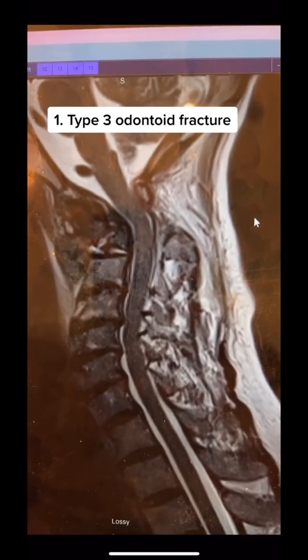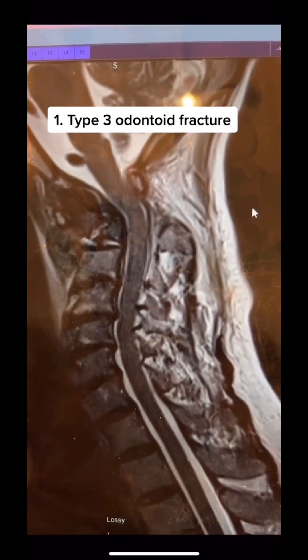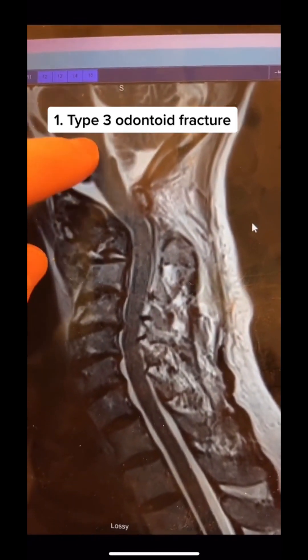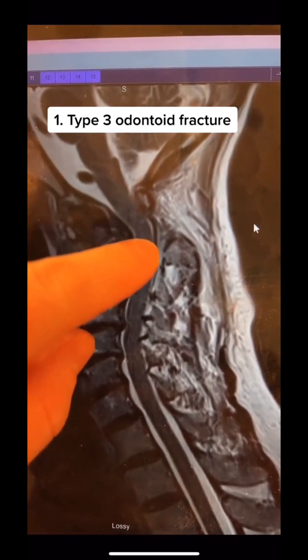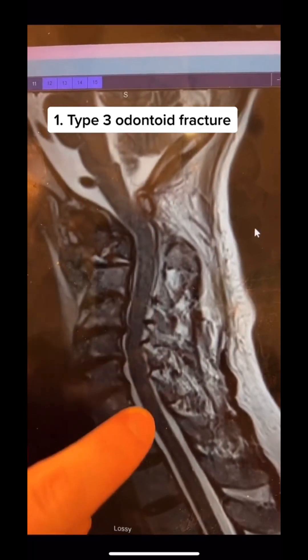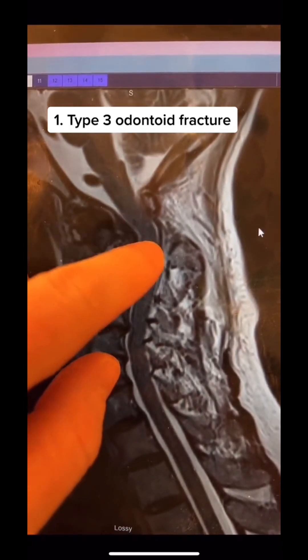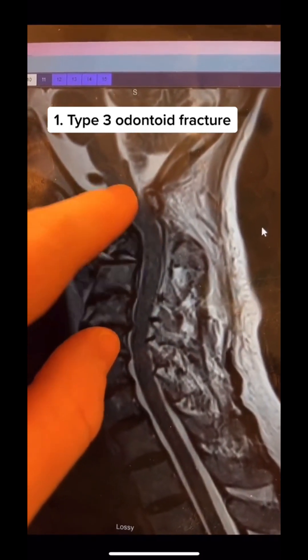The patient also has some kyphosis and cervical cord compression on the MRI. You can see the spinal cord coming down through here — this gray structure — which normally should not be this narrow right up in here. This compression of the spinal cord is responsible for the patient's weakness.